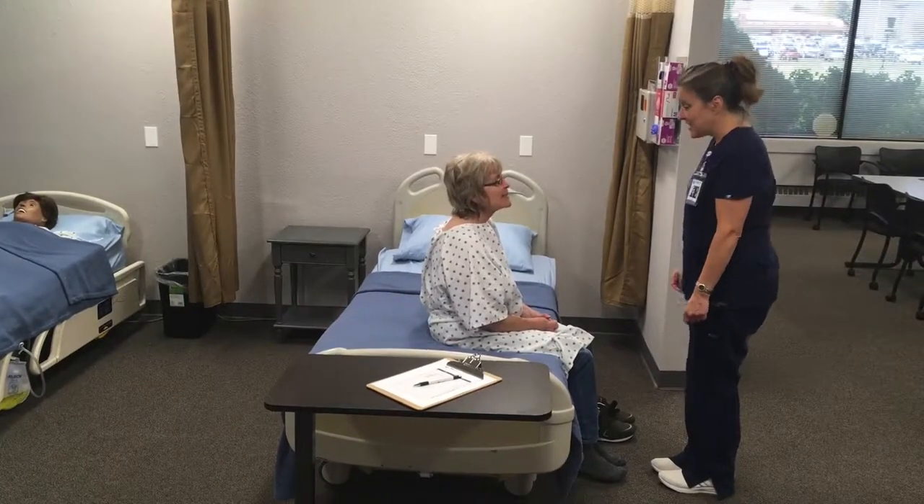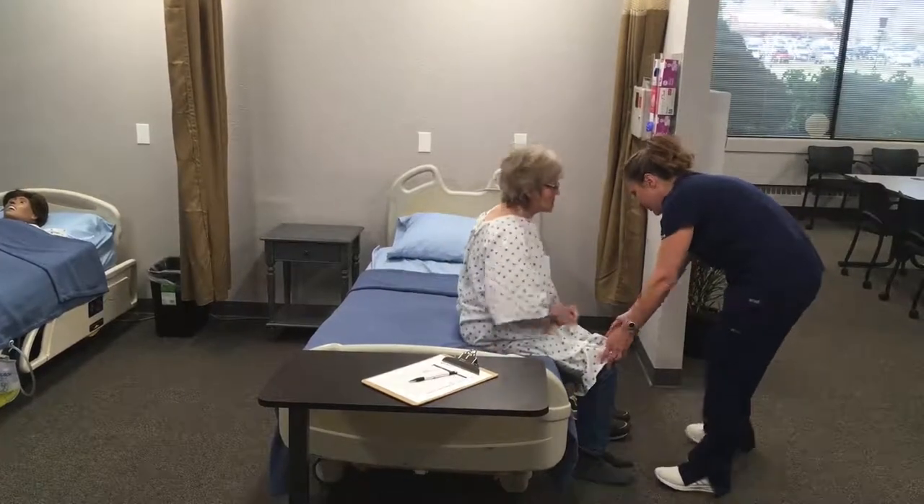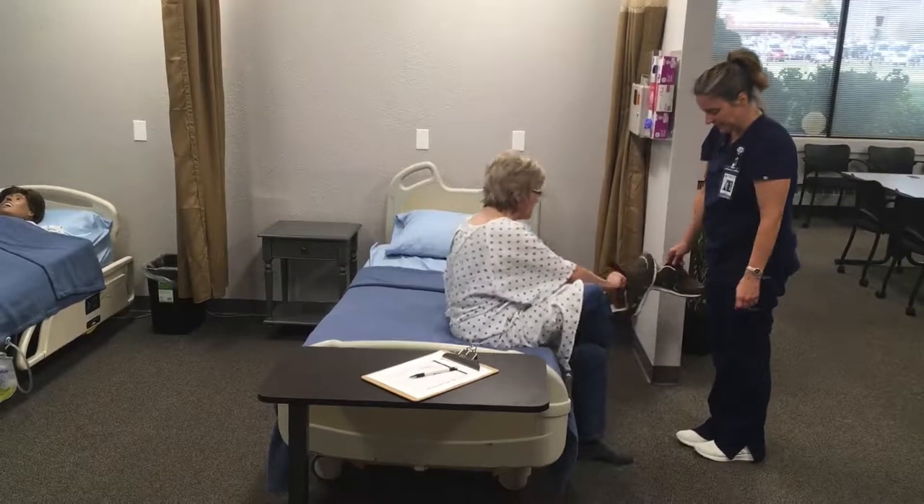Today we need to get your weight. So first I'll have you scoot forward so both your feet are flat on the floor. Now I'll have you put your shoes on for me.